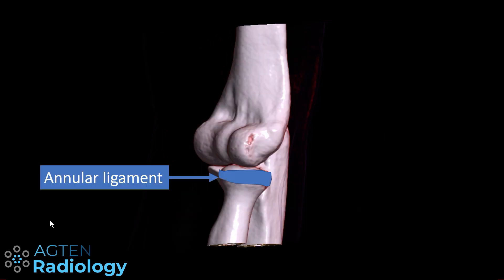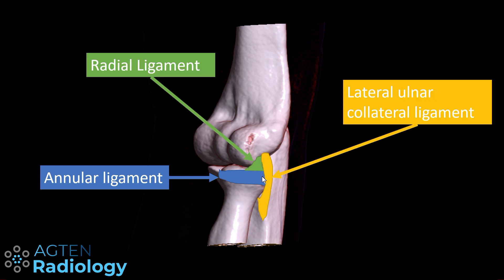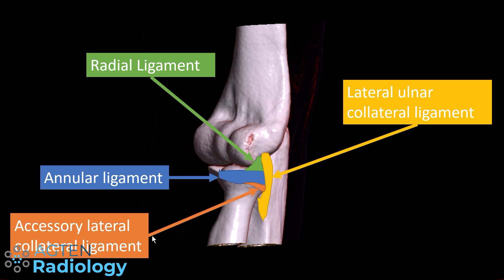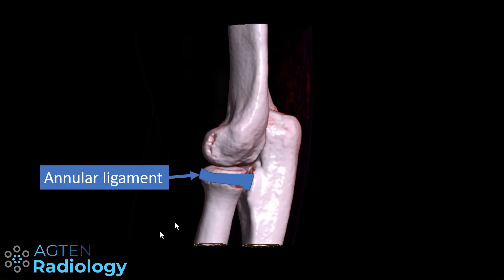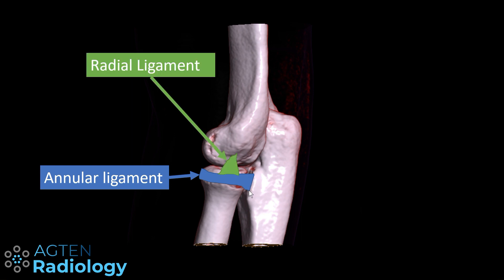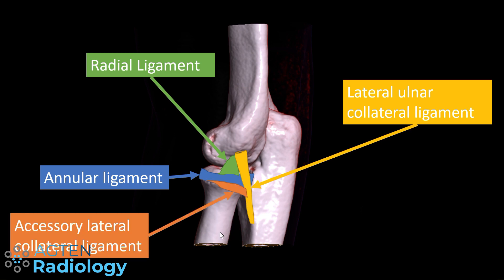Turning further, we can see the annular ligament and the radial ligament, which has a fan-shaped appearance here. Behind the radial ligament is the lateral ulnar collateral ligament going down onto the tubercle and the supinator crest. In a more lateral view, the annular ligament keeps the radial head in place, the radial ligament is visible anteriorly, and posteriorly is the origin of the LUCL inserting onto the crest, along with the accessory lateral collateral ligament.